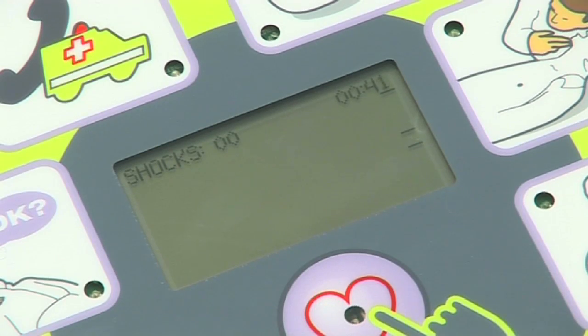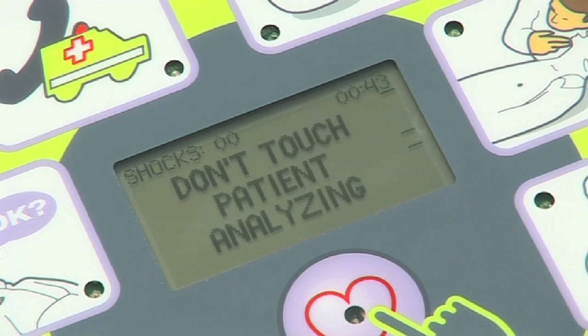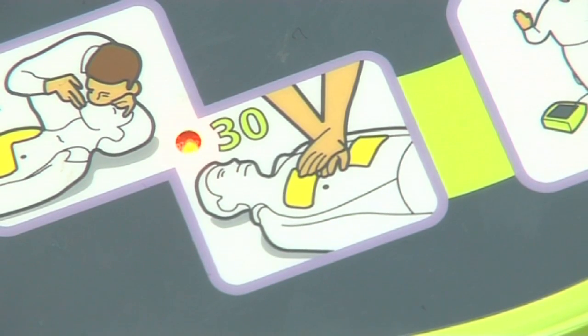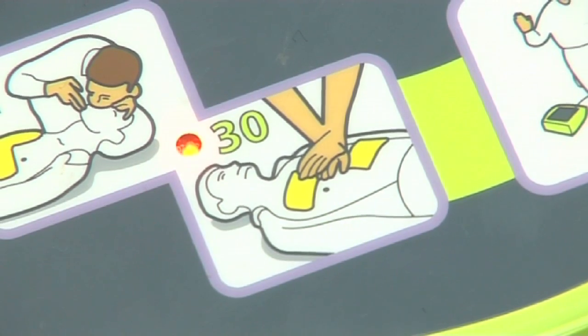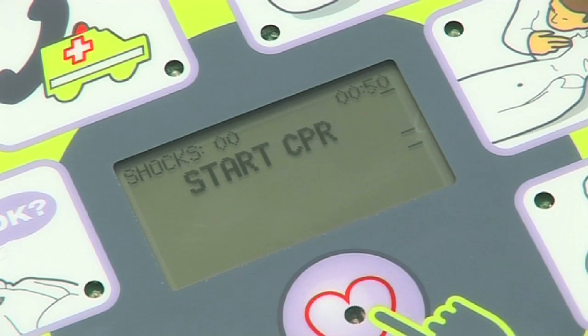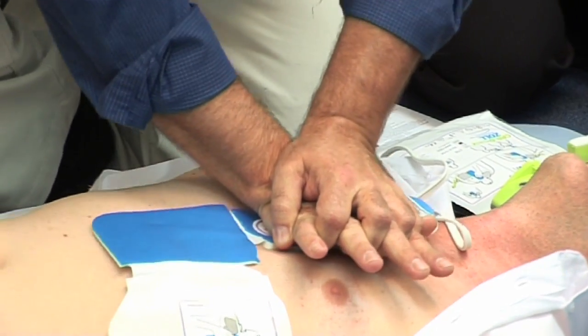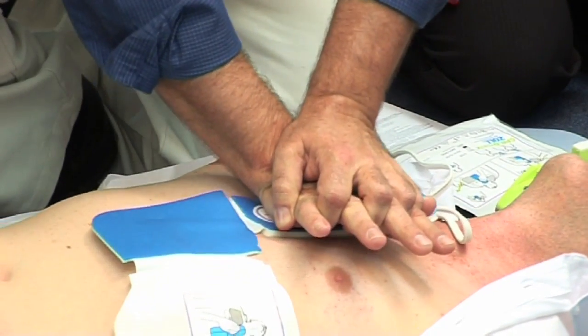In half of all cases of sudden cardiac arrest, the first analysis of the patient advises that no shock be delivered. No shock advised. If there is no sign of circulation, then the unit will advise you to commence CPR.